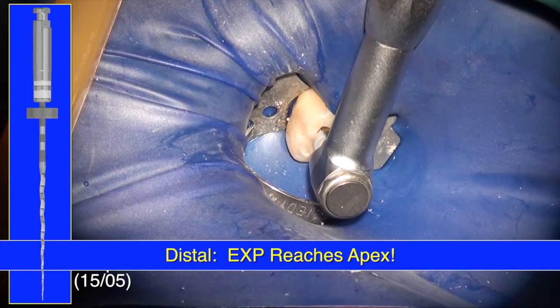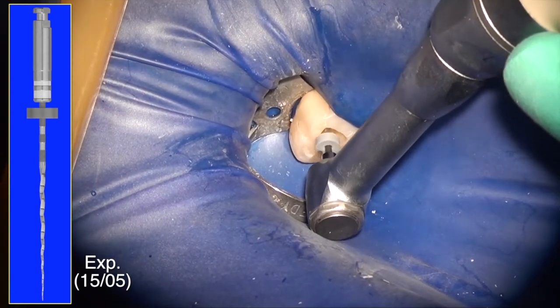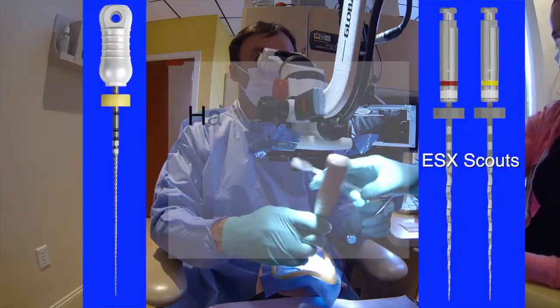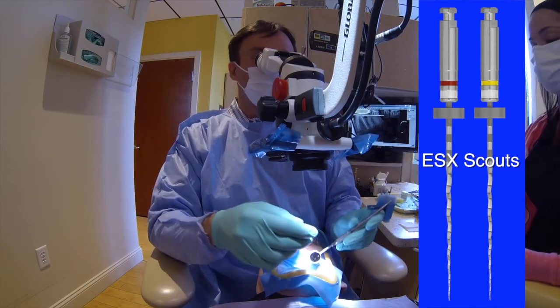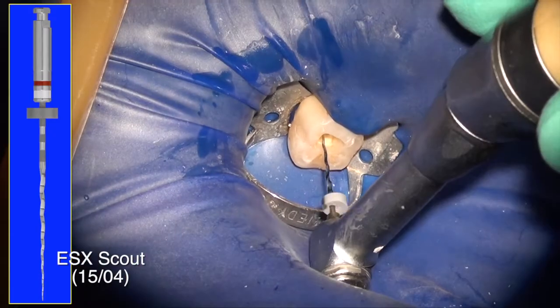Using SSC, I'm trying to get the length, and you can see that on the distal I already reached length with the expediter, but on the mesials I can see that I'm having heavy engagement. At this point I have a couple of options. I could either just hand instrument using my 8, 10, and 15, or I can use the scout files, and I prefer to use the scout files because they're far more efficient.